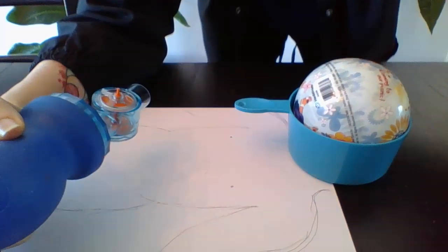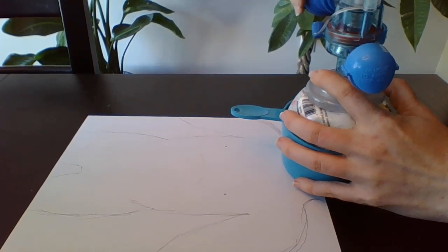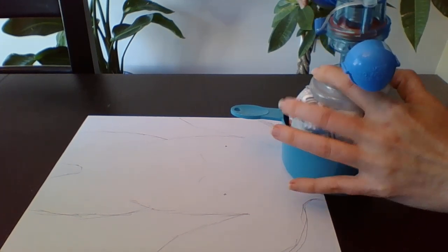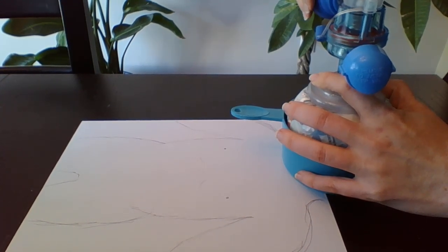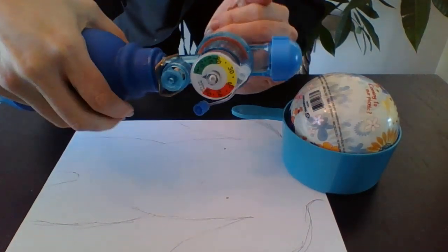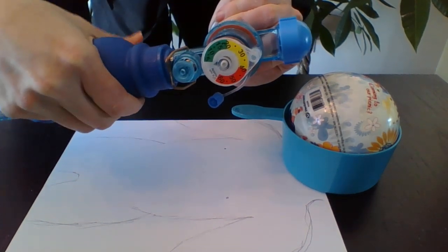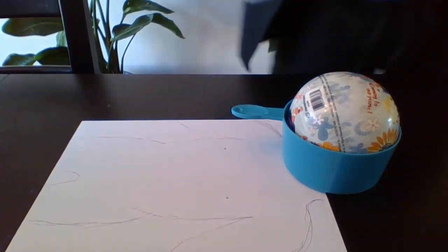But again, we're going to say that this is a scenario where the baby is not quite as vigorous as all that. So we're going to go: breathe and 1 and 2 and breathe and 1 and 2 and breathe and 1 and 2 and breathe and 1 and 2 and breathe and 1 and 2 and breathe. And that's 5. We're going to say that we did that for 15 seconds. And it looks kind of like this. You're going to do a steady 1 and 2 and breathe and 1 and 2 and breathe, steady up to that 30-40 range.